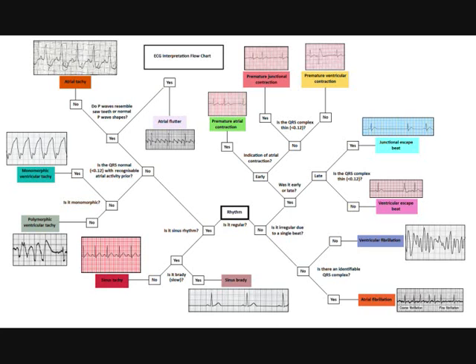On the other hand, if it's not normal and the QRS is quite wide and fat, we can see that it must be a premature ventricular contraction. That really is a good picture of your irregular rhythms as well as your one-off rhythms and characterising them.